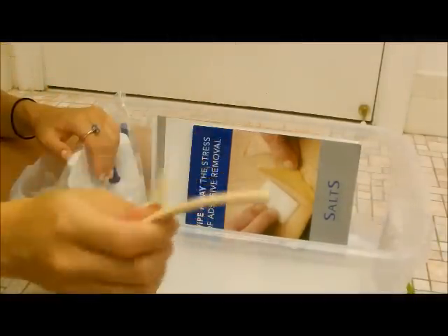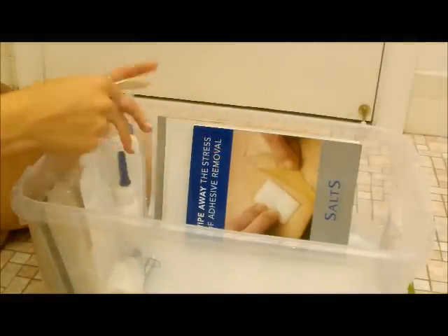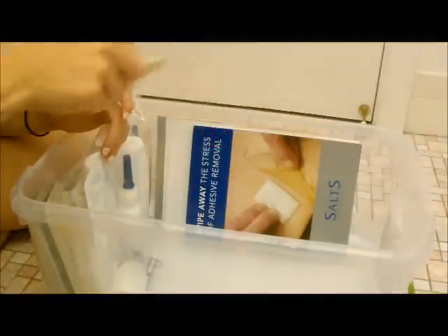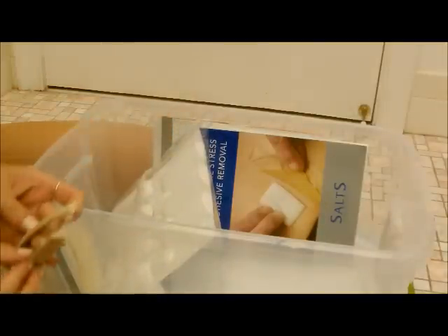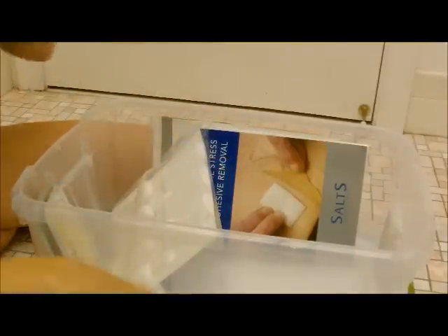I keep a few extra clips, just in case. I keep a rounded one, which I believe are the ones that Hollister give out. And then I have this flat one, which is a lot smaller. I really like these more than I like the curved ones. I don't even use emptying pouches anymore. I generally use the closed pouches. But, you know what? Might as well keep them on hand. You don't know what's going to happen.